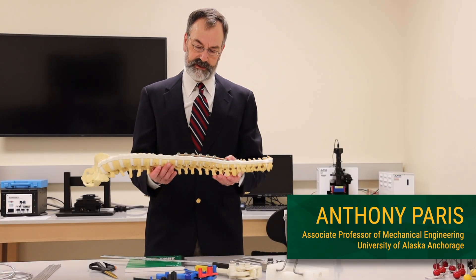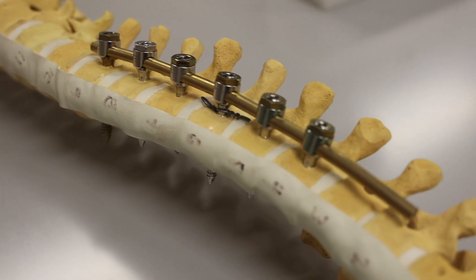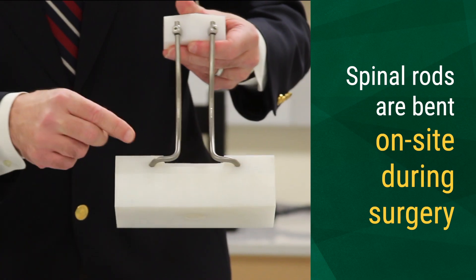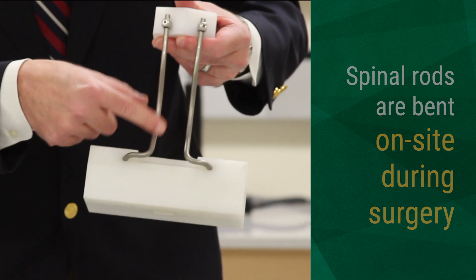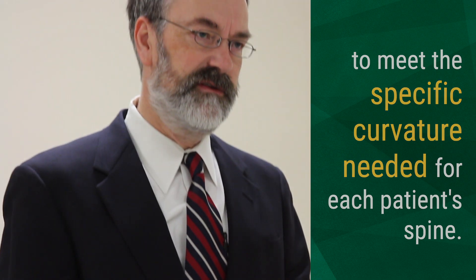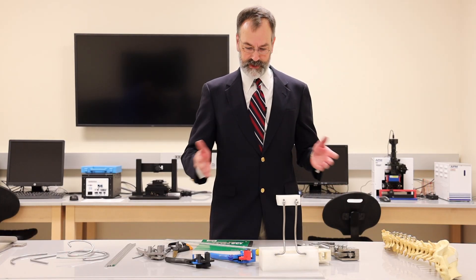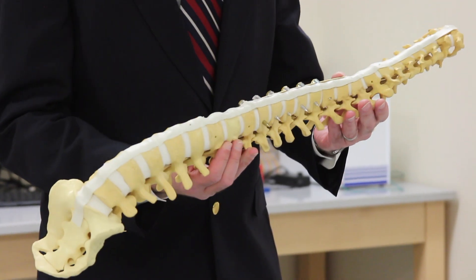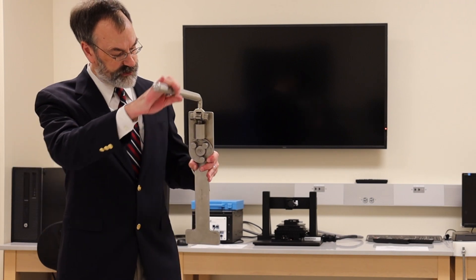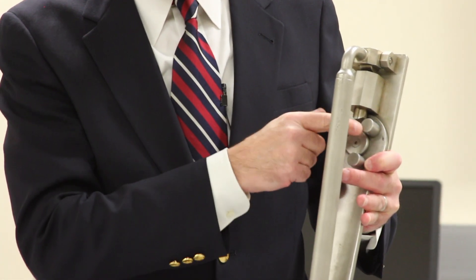The goal is to be able to take a spinal rod and bend it to the desired shape during spinal surgery. The patient is on the table, their spine is exposed, they're under anesthesia, and the clock is ticking. Currently, the two methods that are used to bend the rods require leaving the patient's side.